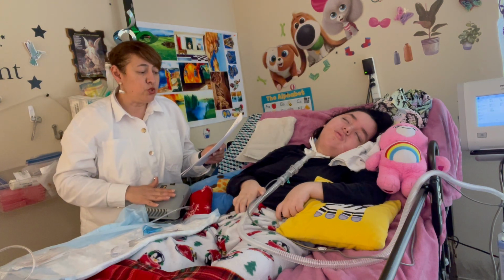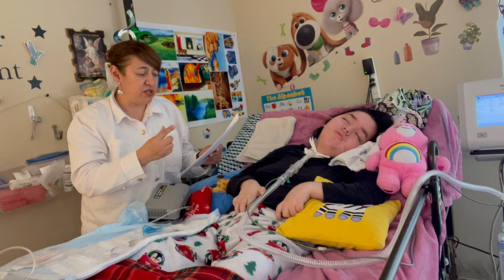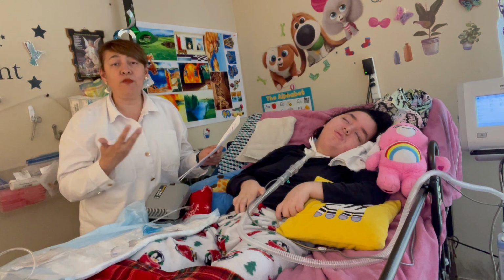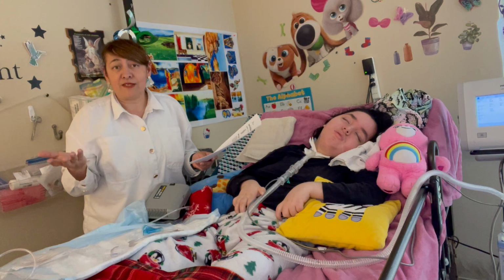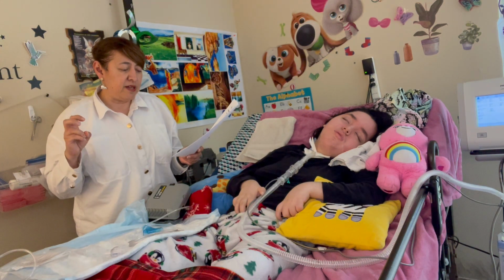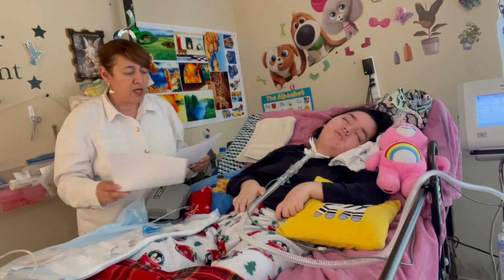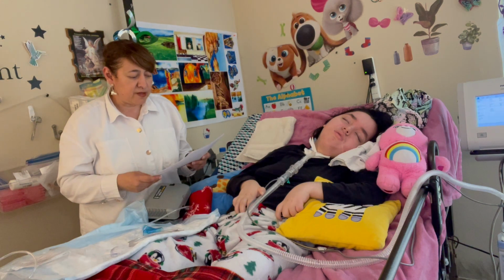The nebulizer is usually connected to a machine that pushes air through the nebulizer. The air helps turn the medicine into a mist. When a nebulizer is used, it is called a breathing treatment or nebulizer treatment. But why do I need breathing treatments? You will ask, right? Well, there are some people that have asthma, chronic diseases such as COPD, or obstructive pulmonary disease, lung infections such as pneumonia, and severe allergic reactions.